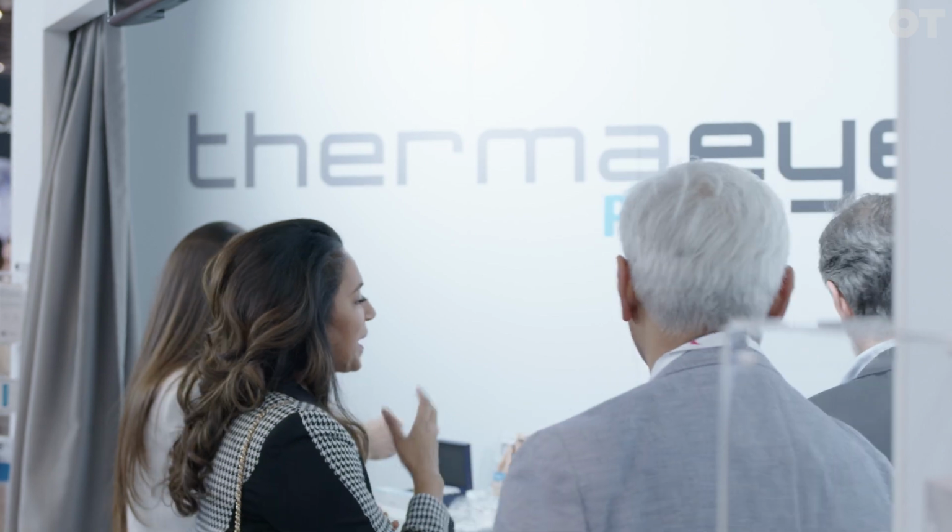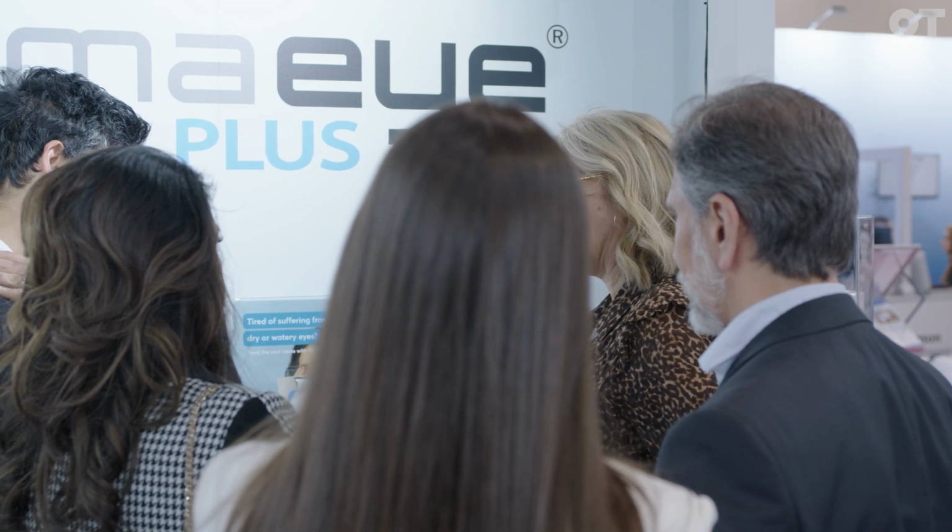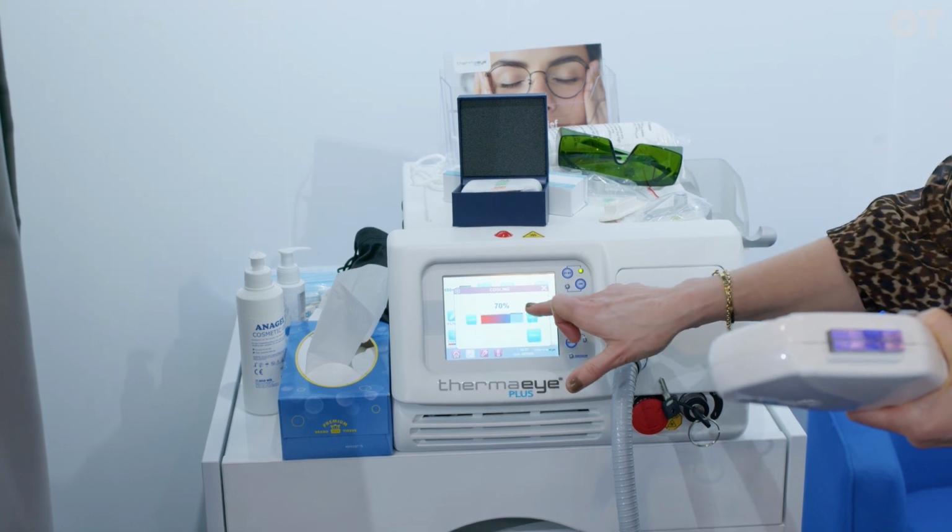I have a big dry eye diagnostic system. So if a patient comes in with dry eye, I would show them their meibomian glands, I would show them their tear film. We have a look at staining, and you explain to them that the reason they're struggling with dry eye is because the tear film has 3 layers to it, and the oily layer, which I call their WD-40, which is the comfort layer at the front, the meibomian glands aren't working properly, and basically we need to give them an energy boost and we need to restart them. You show them videos of the meibomian glands, you show them their tear film, and most have been suffering for ages. They're chronic sufferers, and I think they understand.